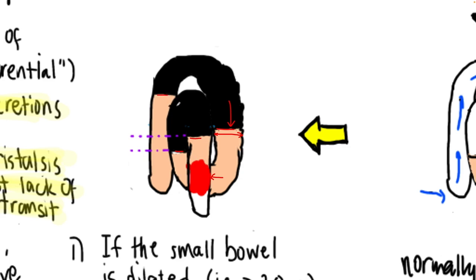Now in this picture, how many loops of bowel can you identify? A single loop is defined as a single U-shaped or inverted U-shaped tube of air. So this is one loop and this is a second loop. It is important to identify a single loop because we are going to measure the differences in height of the air fluid levels within it — air fluid level 1 and air fluid level 2 — and the difference in height between these two will be considered.